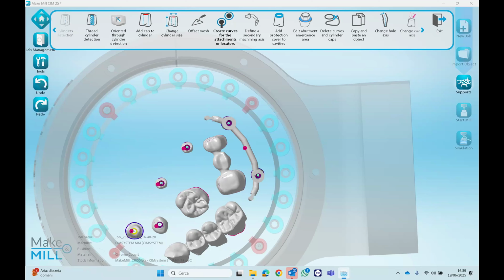This will automatically tell the software to apply the part strategy to work on these two connections with a specific strategy, using specific tools. So you can use smaller tools to get into the smaller areas without using the tools in the main strategy.